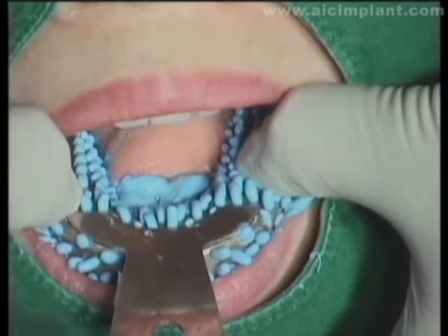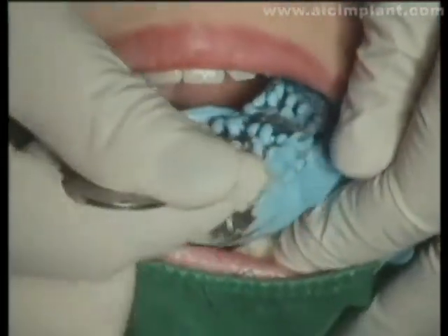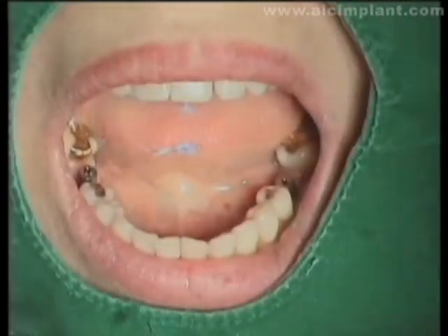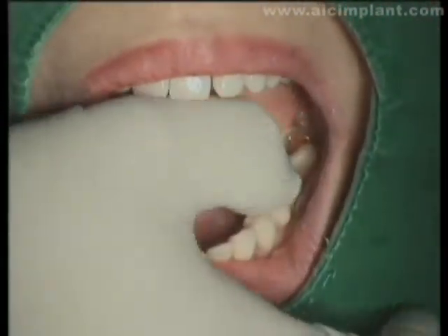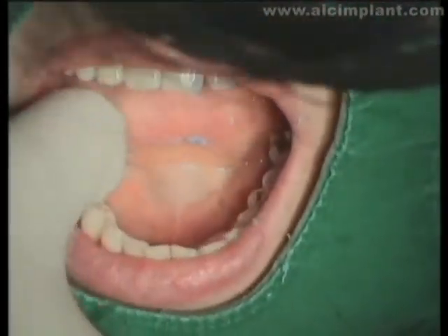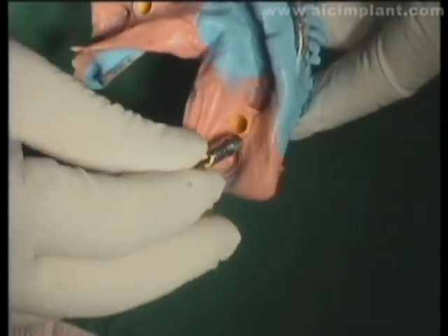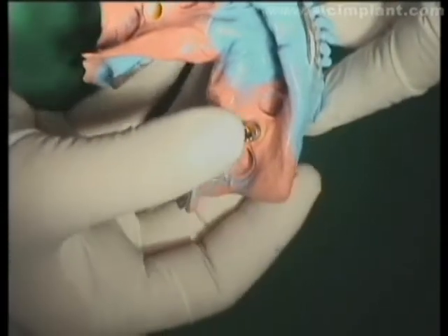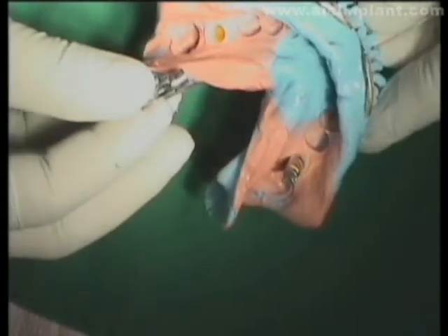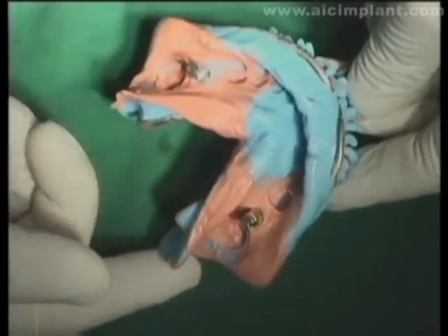Remove the impression body once the impression material has set. The plastic component is attached to the impression body, like this, when the impression body is removed. A plastic protective cap is then attached to protect the abutment. Afterward, the analog is attached following the removal of the impression body. This is sent to the dental laboratory, and a model is fabricated with G-mask for the final prosthesis fabrication.